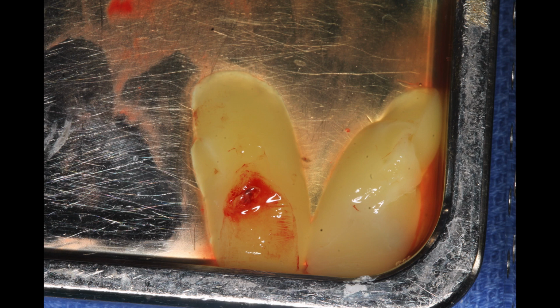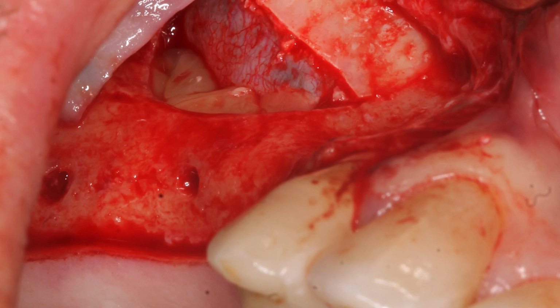Here we see some images of the concentrated growth factors before it's pressed. That is lightly packed so that it has direct contact towards the Schneiderian membrane, which is truly where the osteogenic potential comes from. Not necessarily the bone, it's actually the blood supply, and the progenitor cells will come into the sinus cavity, into the future bone site, through the Schneiderian membrane. So it's sensible to have the growth factors directly contact that area so we can start the progenitor cells to migrate into the area much more efficiently.